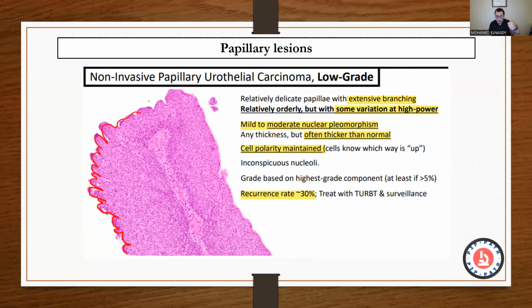How do you determine that there is no significant atypia? Whether you see mitosis or not. Believe me, this is the key thing. Look for mitosis. If you see a lot of mitosis, which is very obvious to whoever, even a blind person can see these mitotic figures, then you're dealing with high atypia or high-grade cytology. So you might think about calling it papillary urothelial carcinoma high grade. However, here you don't see that much mitosis. However, you see some cytological atypia. This is what we call low-grade atypia. Still, there is order, there is organization, and there is increase in urothelial thickness.